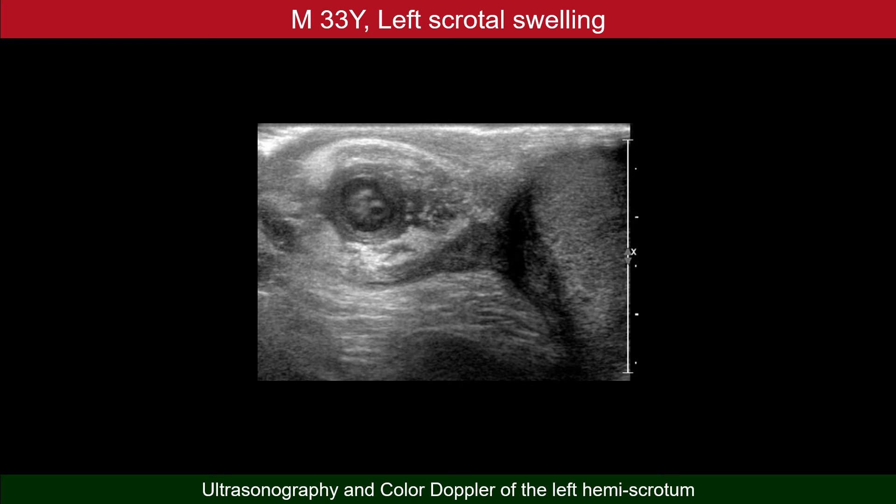This is quite impressive — live filarial worms — what is termed as the filarial dance sign.